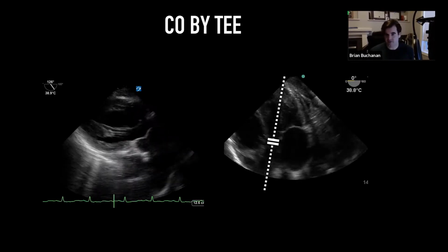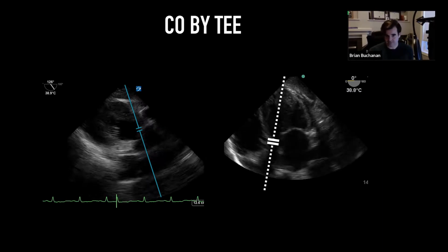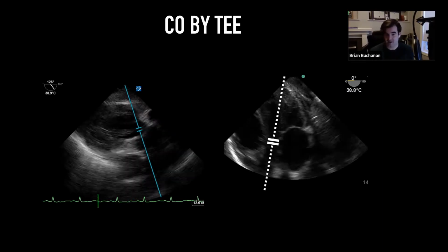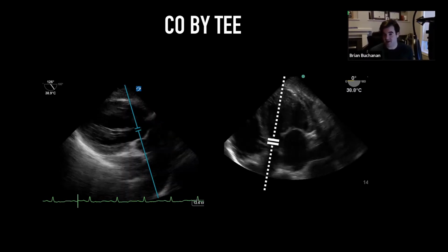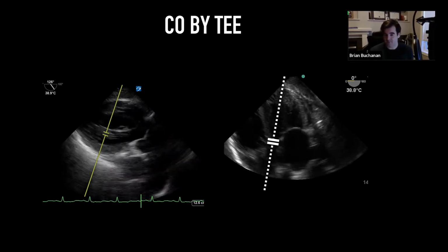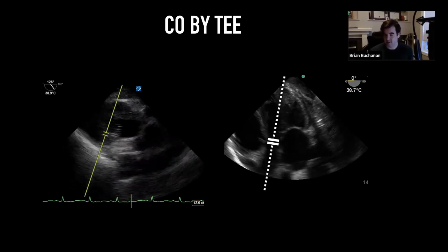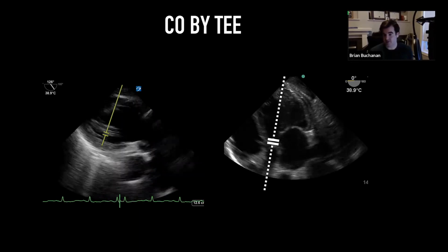Certainly with transesophageal echo, we can use other views shown here. On image left, we have a transgastric long axis with the outflow tract around 5 o'clock, and this angle will occasionally offer a very helpful angle of intercept for that flow. On the right, we have our deep transgastric view, where the angle is very strong for interrogating that flow.